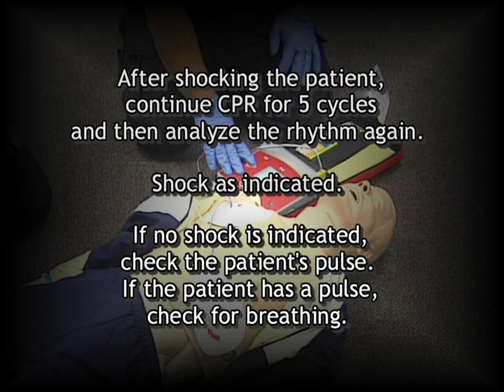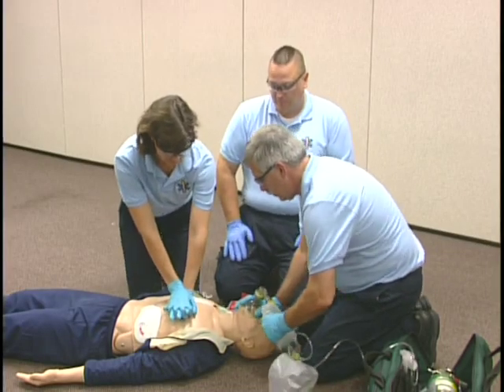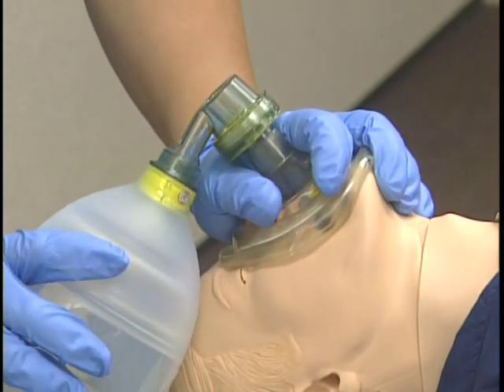Shock as indicated. If no shock is indicated, check the patient's pulse. If the patient has a pulse, check for breathing. If the patient has a pulse and is not breathing adequately, provide artificial ventilations with high-flow oxygen and transport.